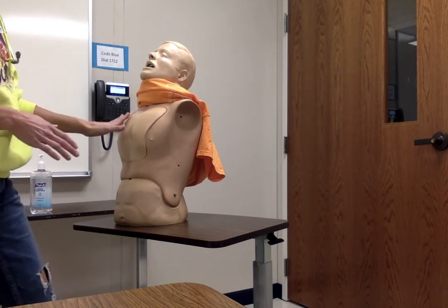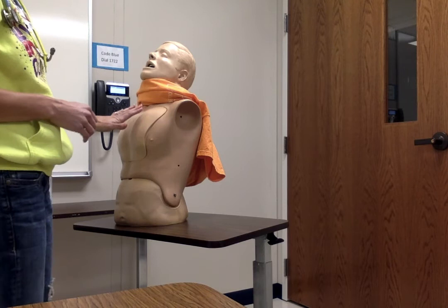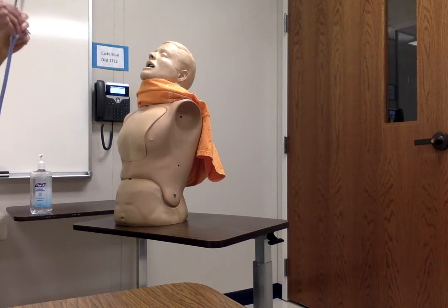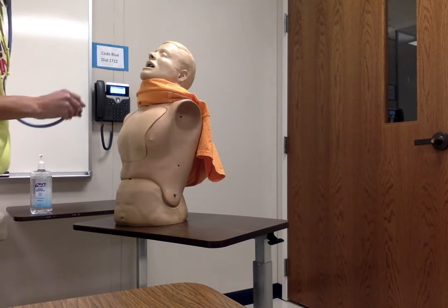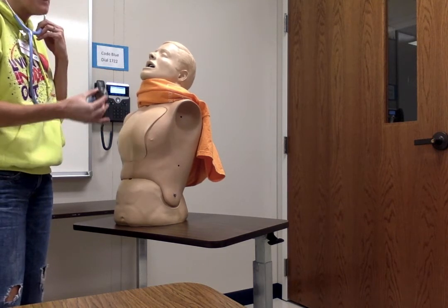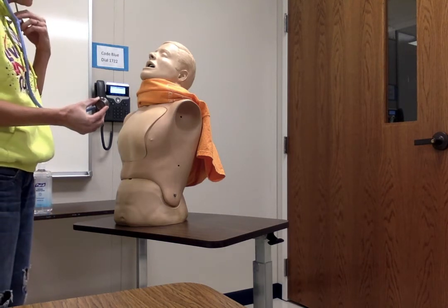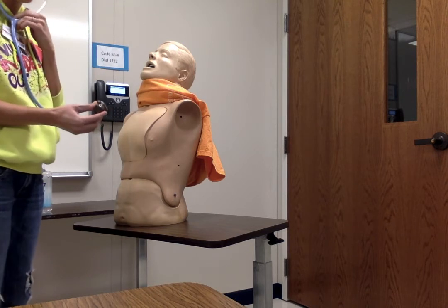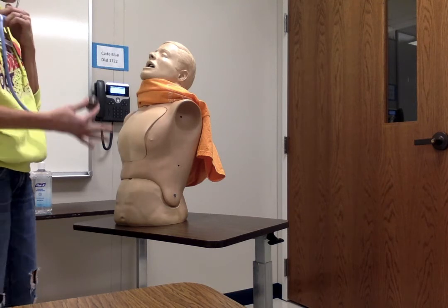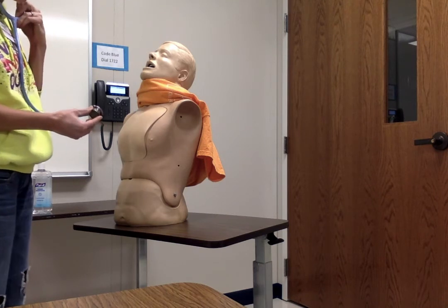Now, when we're listening, we are going back and forth, comparing the left and the right side. We want to start in one area and work our way down. You're going to go to one side, and this is where you would instruct the patient to take a deep breath in and a breath back out. I've also observed when people do this really fast, the patient has a tough time taking deep breaths, so sometimes you may need to slow down a little bit and let the patient just breathe normally rather than trying to take such deep breaths.